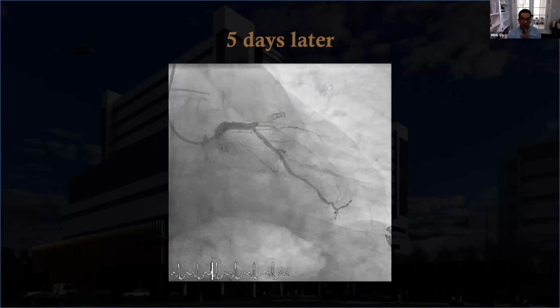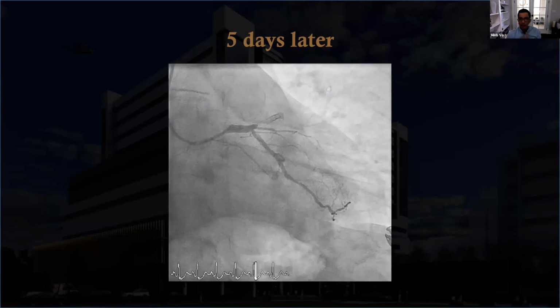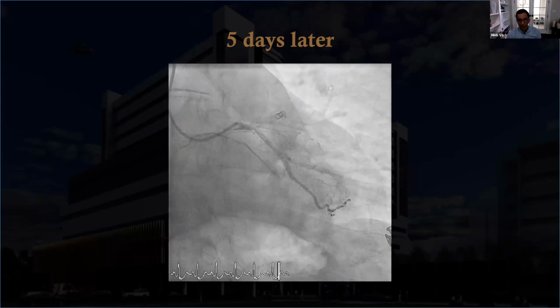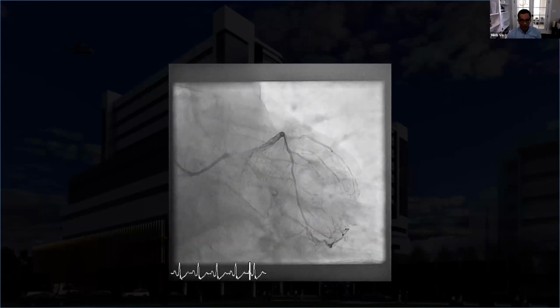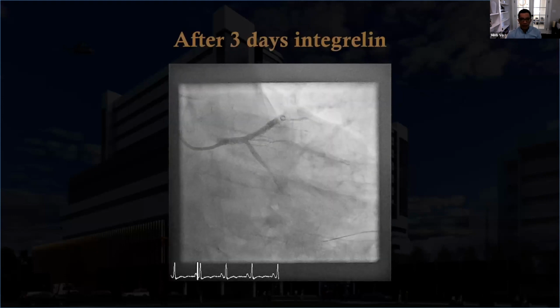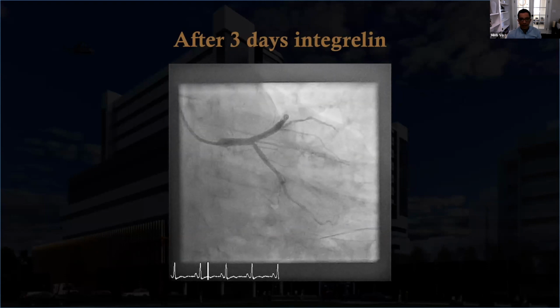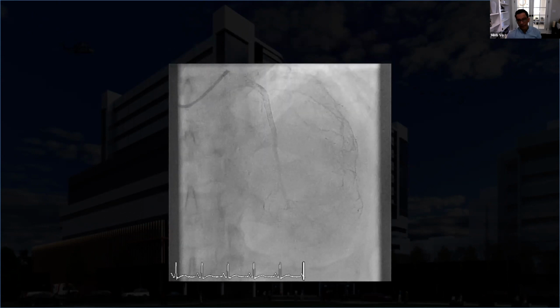So now I'm thinking, when he came back, I'm thinking to myself, should the left circumflex have been done? Probably not, maybe not. If we did coronary physiology, we may have escaped with it. But now he's got 2 stent thromboses. He's sicker than ever because, again, I truly believe this is from a pro-thrombogenic state from a COVID patient. So then we ballooned. We got this thrombus in the left main. Just for completeness' sake for the audience, 3 days of Integrilin, it embolized distal in the LAD, and now he's left with this. Left main, left circ stented.